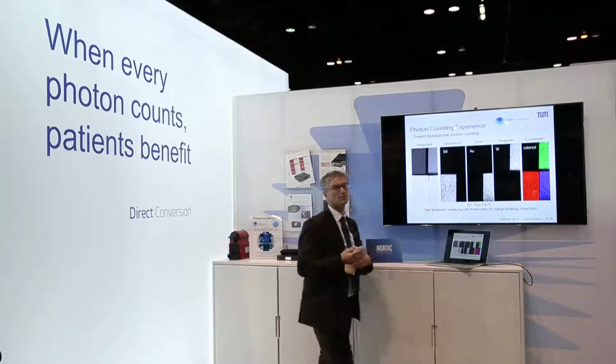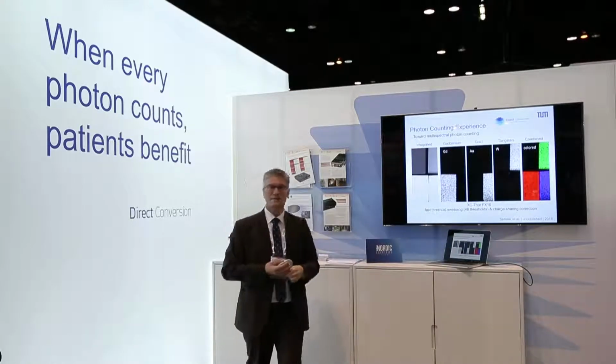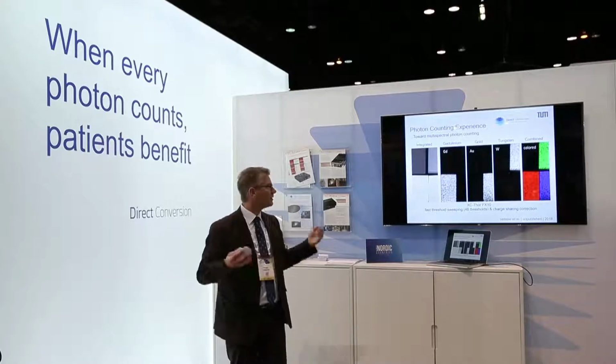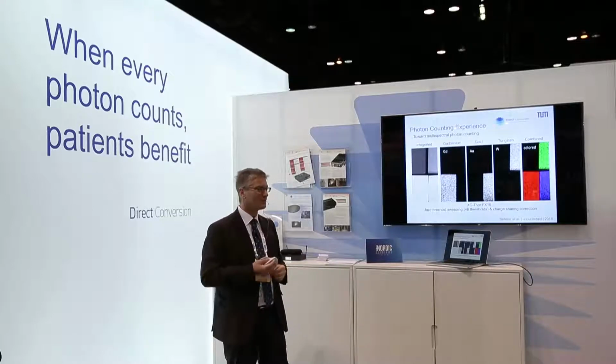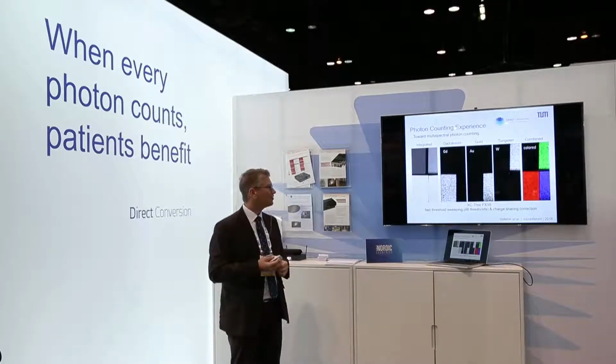So in this way you could get access to as many K edges as you wanted, but limited is of course how many contrast agents you can inject into the patient, and how many you get approved in the end.